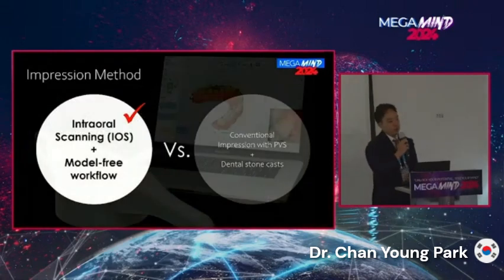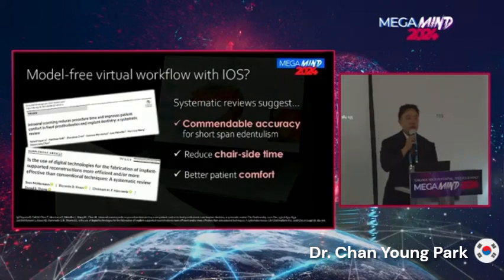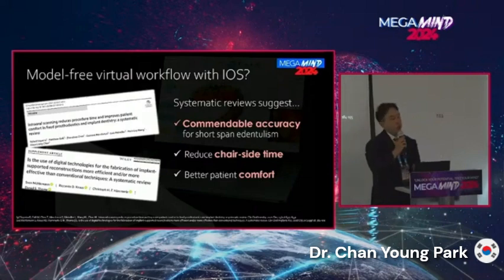And for the impression method, we chose intraoral scanning with model-free virtual workflow over the conventional method, because systematic reviews say that for cases with short span edentulism, we can acquire commendable accuracy using the virtual workflow while reducing the chairside time and with better patient comfort as well.